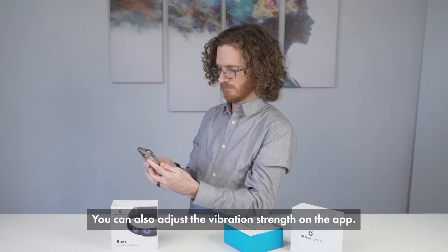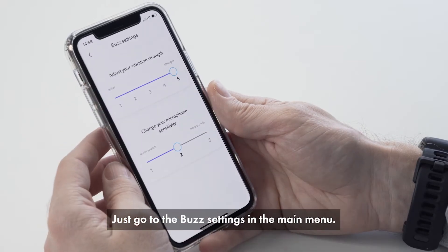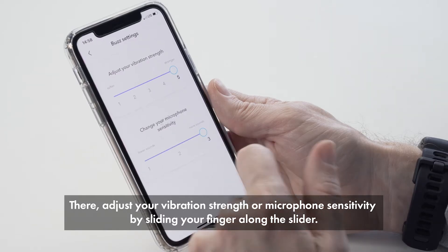You can also adjust the vibration strength on the app. Just go to the Buzz settings in the main menu. There, adjust your vibration strength or mic sensitivity by sliding your finger along the slider.